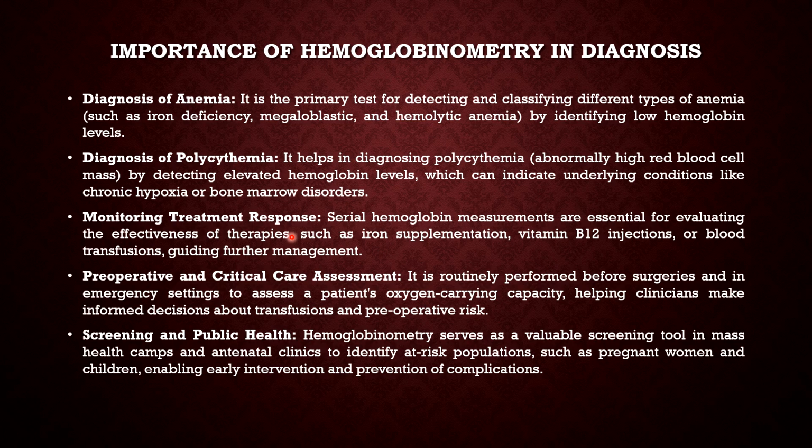Then monitoring the treatment response. That means if a person is found to have a low amount of hemoglobin and some supplementation is going on, like iron supplementation or vitamin B12 injections, what is the improvement of that particular patient? That can also be assessed by hemoglobinometry.